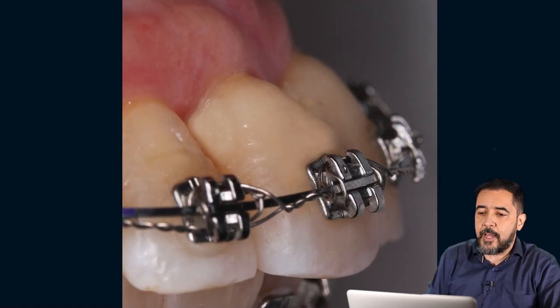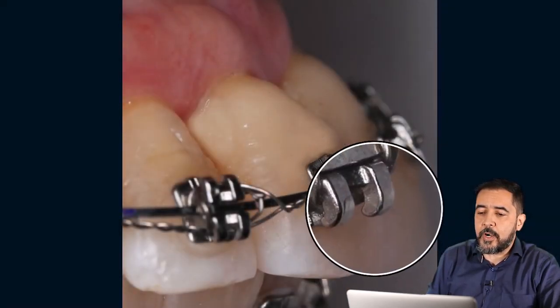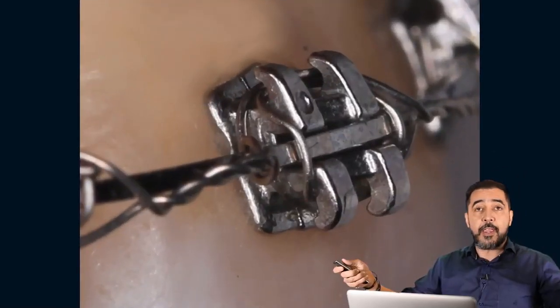Look at the situation. After that, a student of mine called me, we did the torque and we inserted it here, and it was completely passive now. Okay, this is what I wanted.